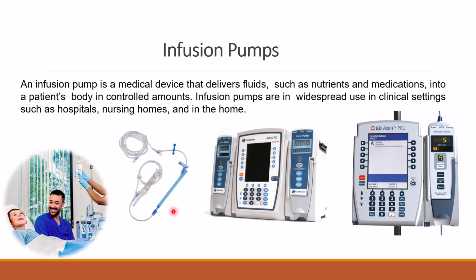So we are going to put the device, one end goes to this bag or to the nutrients, to the medications, to the blood, to the fluids, to anything, and this one will go to the patient. So the infusion pump is used to deliver medications or fluid in a very controlled amount and in a very controlled time.